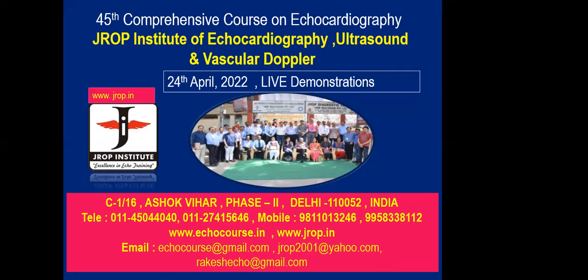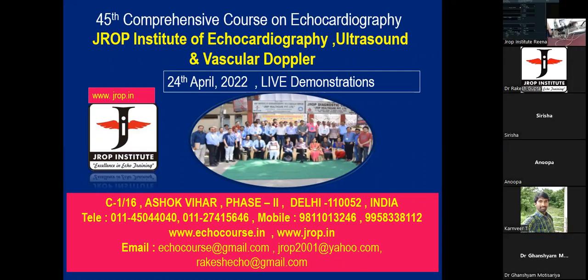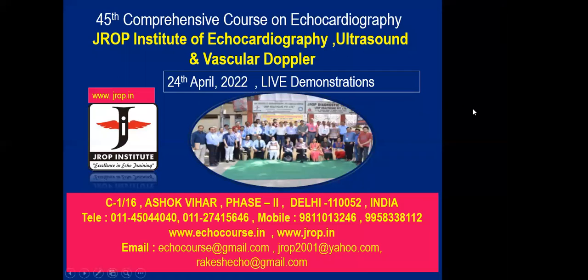And I'll get going. Hello, my subject is lying down over here. We have focused the camera on his chest so that you can see categorically where to put a probe and the basics of echocardiography. That's the aim today. Can you have the screen? The screen is ready.